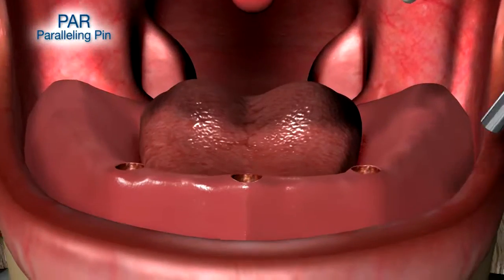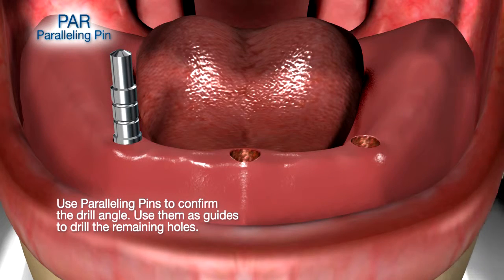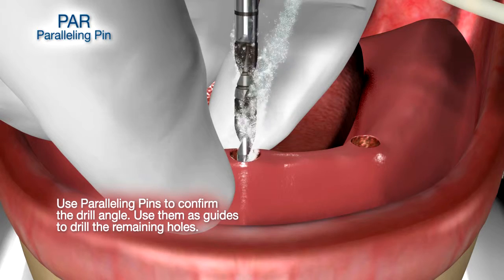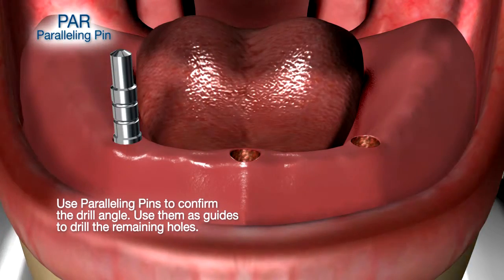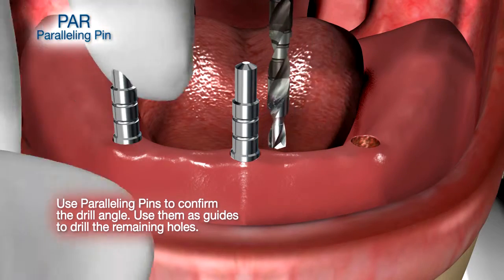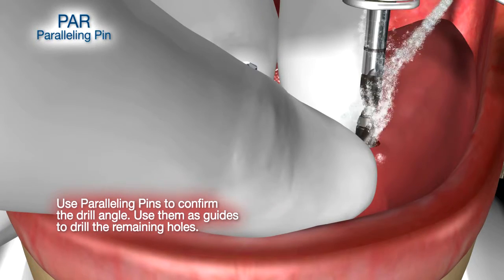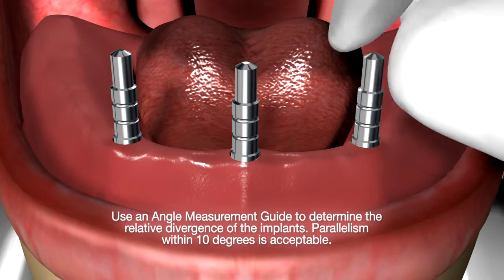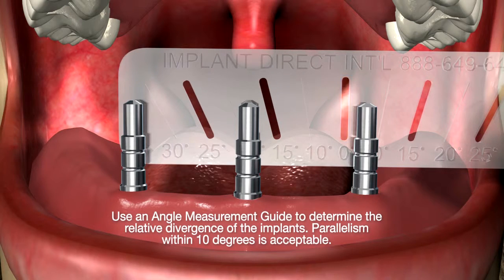Put the paralleling pin in and then repeat the procedure to help you line it up. That's how you work your way around the arch. I recommend using 3 of these implants in the edentulous jaw. The middle one will give you what is called indirect retention. And again, try and get them within 10 degrees of alignment.